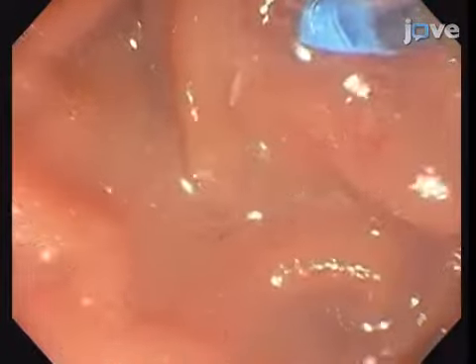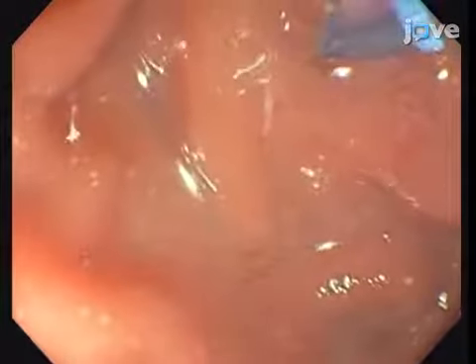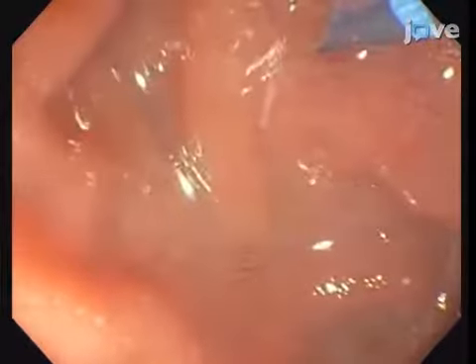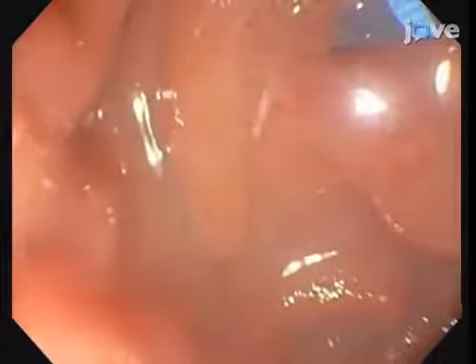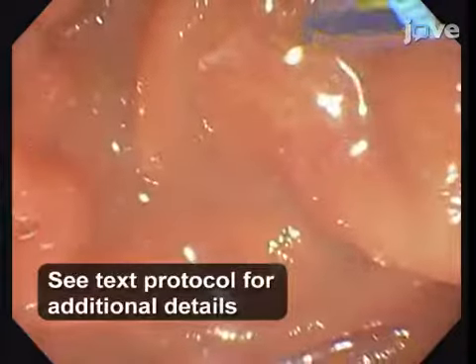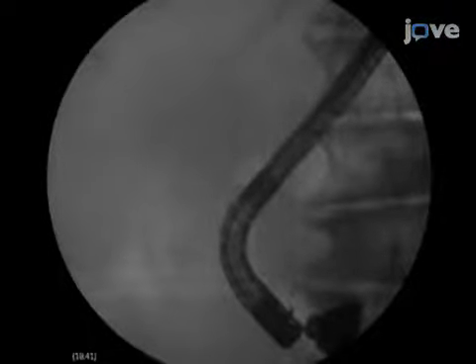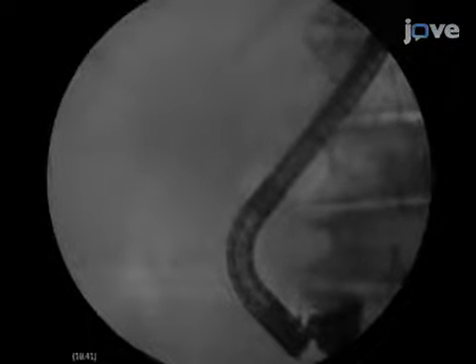Selectively cannulate the common bile duct by inserting a triple-lumen sphincterotome preloaded with a 0.035-inch hydrophilic guide wire. Under fluoroscopic guidance, advance the guide wire to the left hepatic duct, then advance the sphincterotome 5 cm into the bile duct to acquire a stable position.